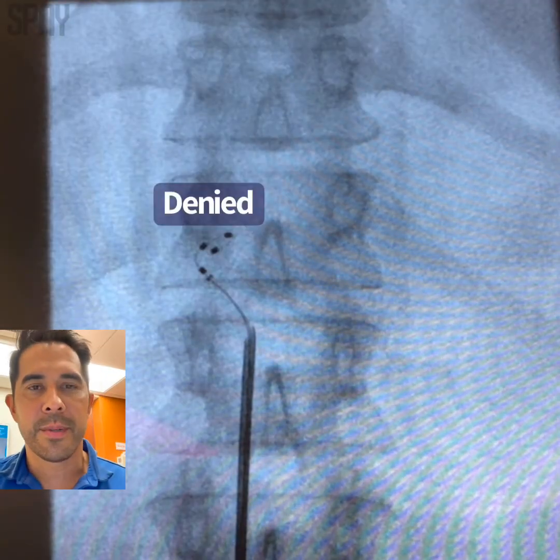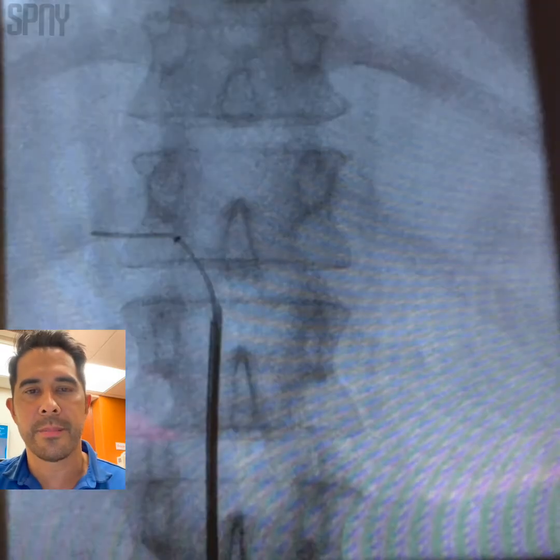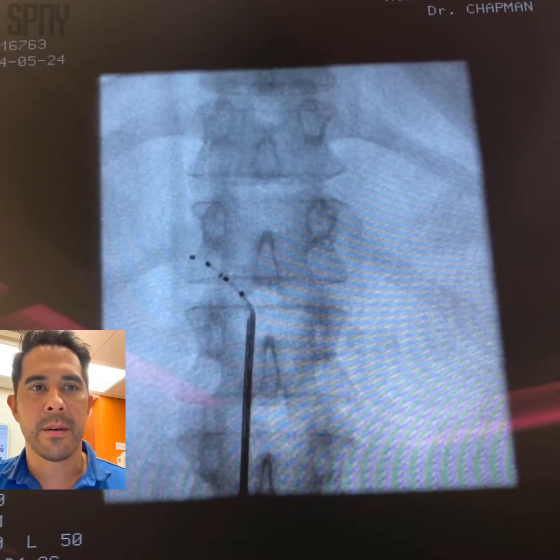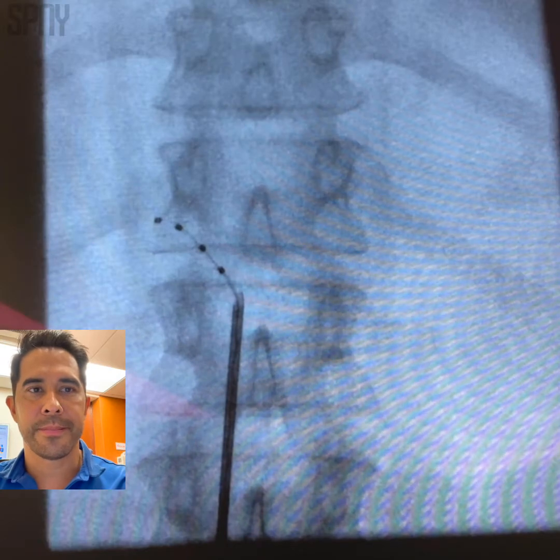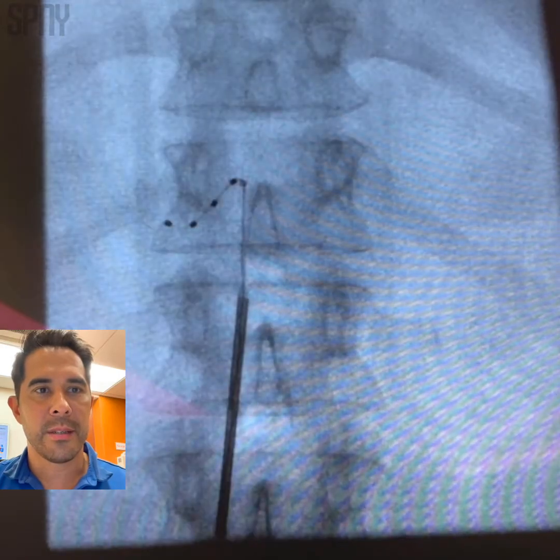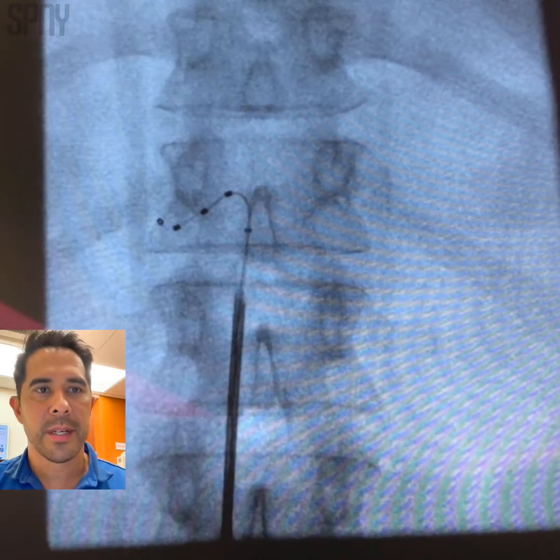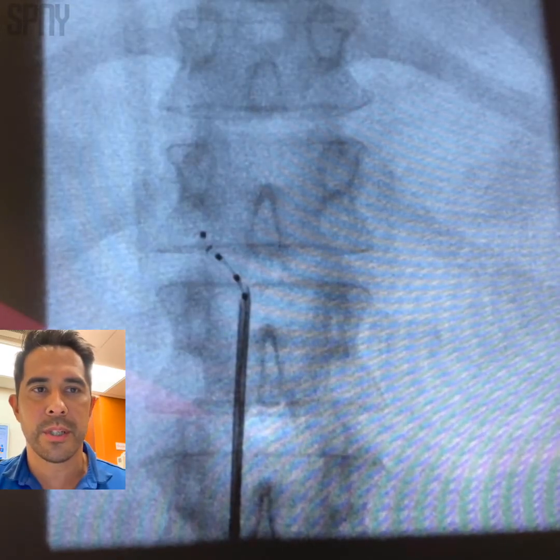So you can see here that we're having some probable access issue in the foramen. Rather than continually try, I took the lead back and after running the K-wire, we're putting the lead back in and trying to pass again. You can see there's a weird bend on the end there. We're trying to save it by pulling it back in — it didn't work. So now we're going to reposition it.